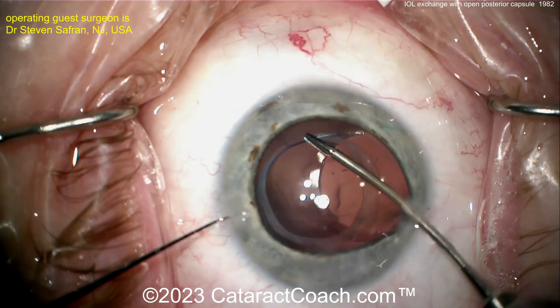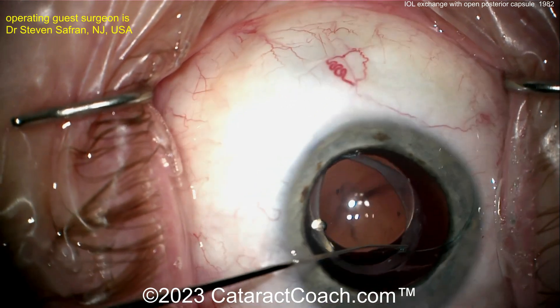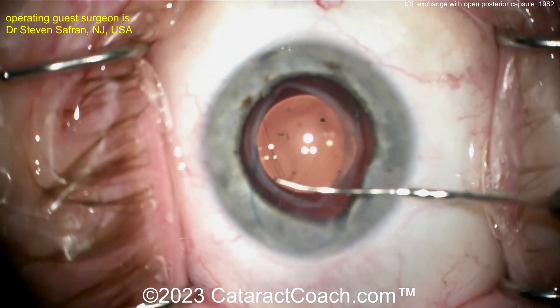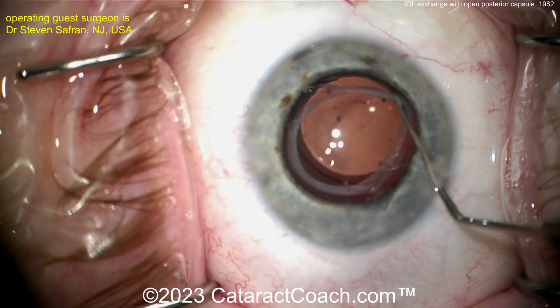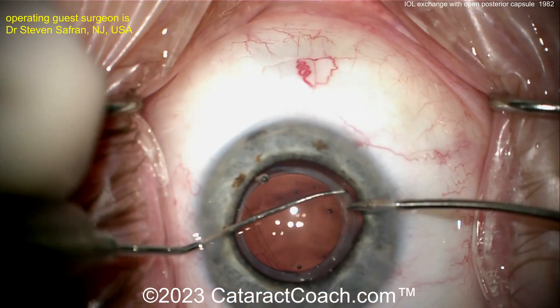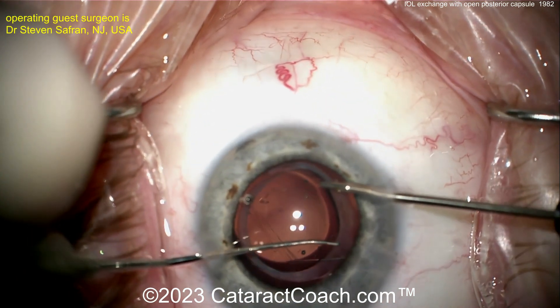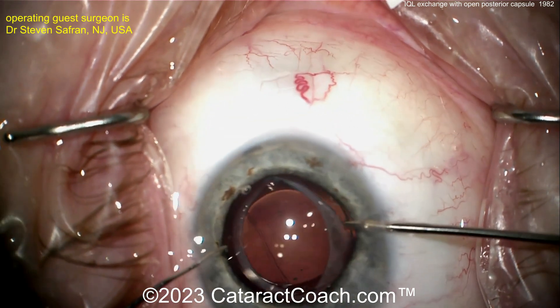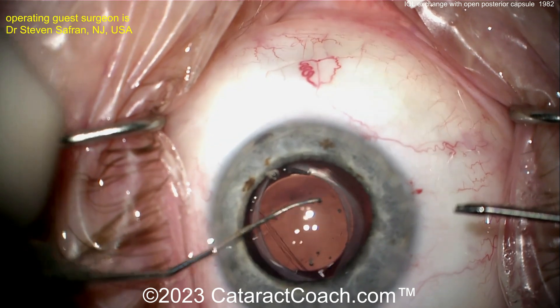Here comes the new lens: a three-piece silicone lens, this looks like a Bausch & Lomb LI-61. It's going to be placed in a reverse optic capture — the haptics go behind the anterior capsulorhexis and the optic comes in front of the rhexis, in front of the anterior lens capsule. Slowly brought into position, nicely centered, and now it's going to be quite stable.